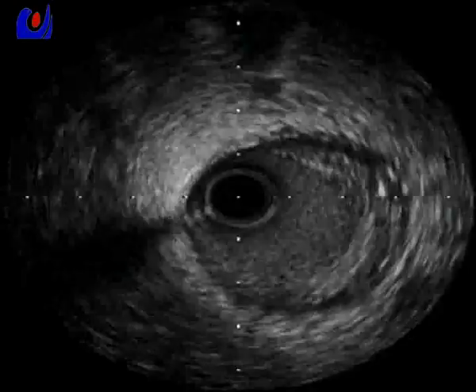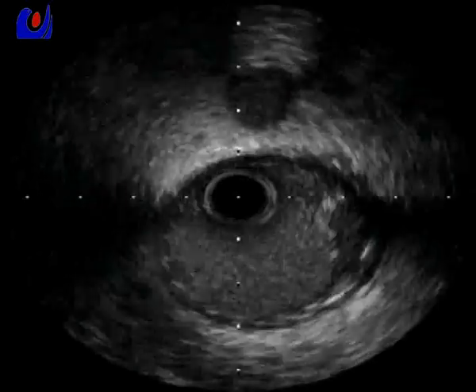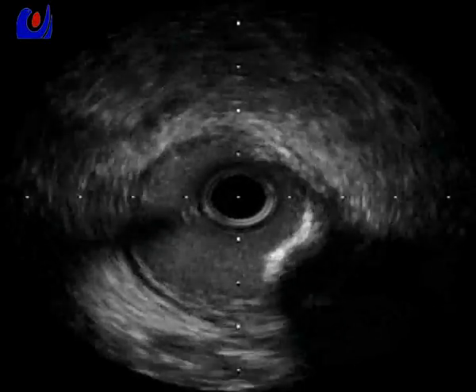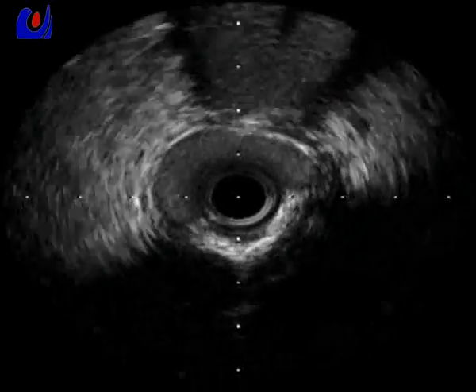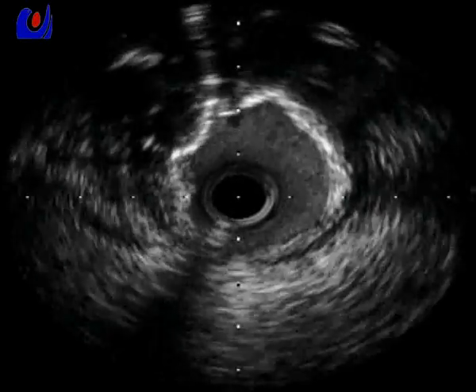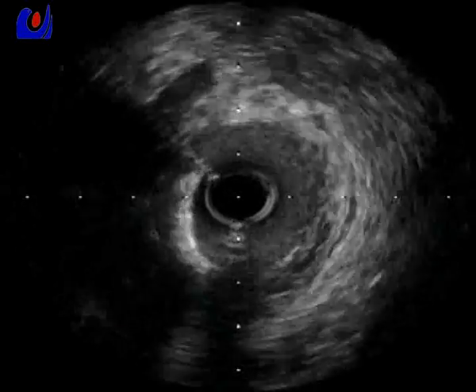And because we have decided to cross over to cover the distal left main lesion and also the LAD ostial lesion, the strategy would be, if the circumflex has not much plaque, we want to do just some plaque, but we'll see. It is near that OM branch. They have some plaque, but it's not to the ostium yet.